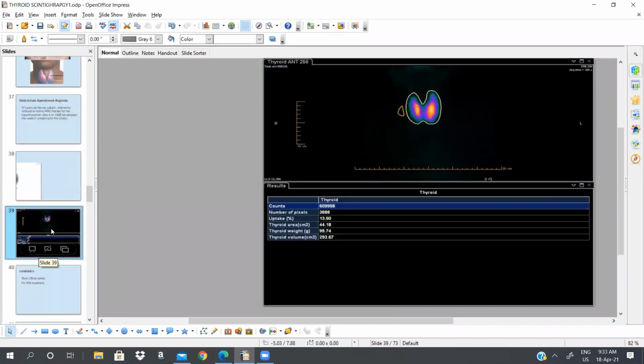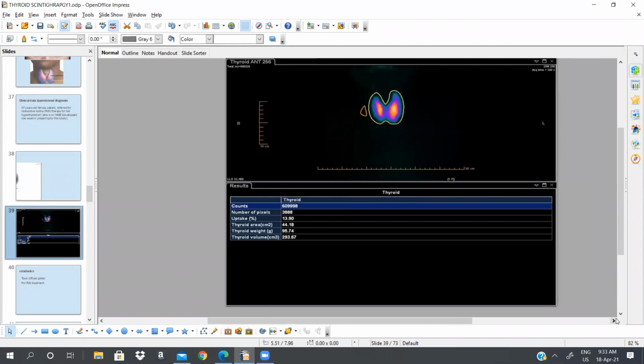And of course, we're measuring the uptake for this patient. You see the percentage uptake is 13, almost 14, and I told you the maximum is up to 4 or 3.75. So the thyroid is truly hyperactive, compared to thyroiditis. In thyroiditis, you also have high T3 and suppressed TSH, thinking that this patient is hyperthyroid or Graves. But in those cases, you cannot see the thyroid and the uptake is low. Here is a real hyperthyroidism. This is the importance of nuclear medicine.